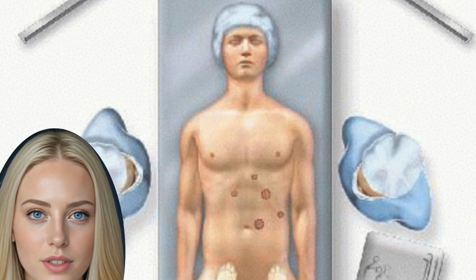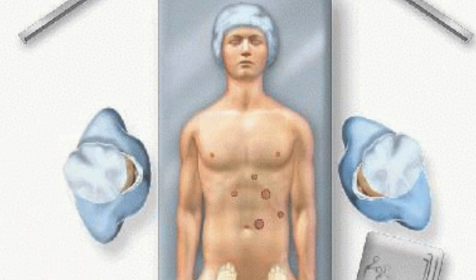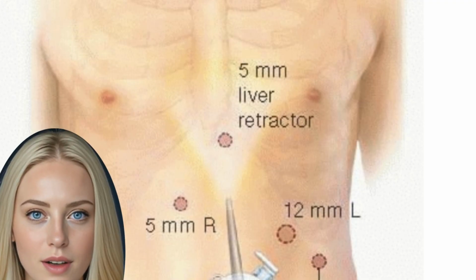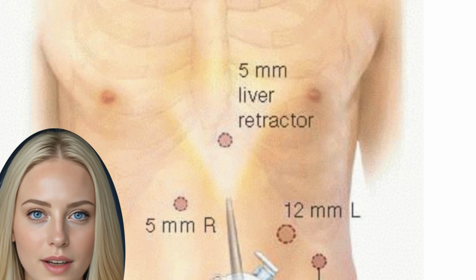Fig 3a-b esophagram. A. Radiography demonstrating a large PH with herniation of nearly the entire gastric lumen into the posterior mediastinum with mesoaxial volvulus. B. Slipped Nissen fundoplication with an intact wrap proximal to the diaphragm. Fig 4. CT of massive PH type 4 in which the entire transverse colon has herniated into the left hemithorax.